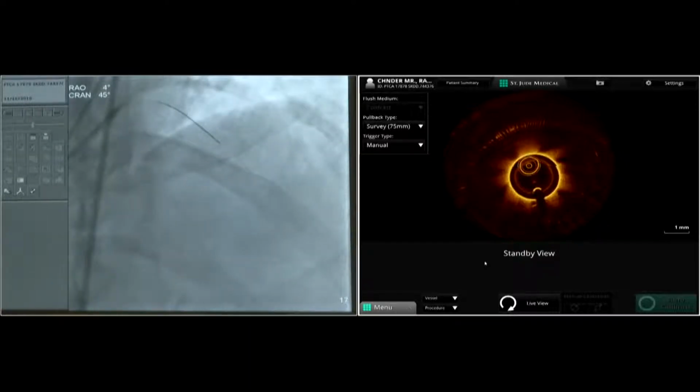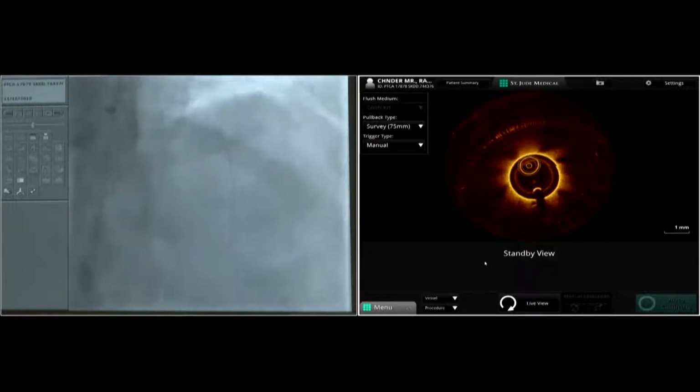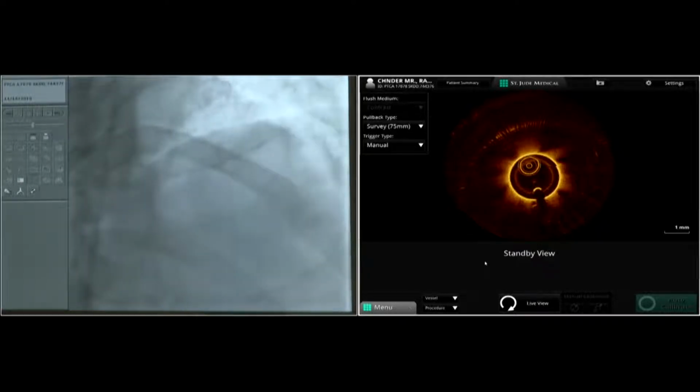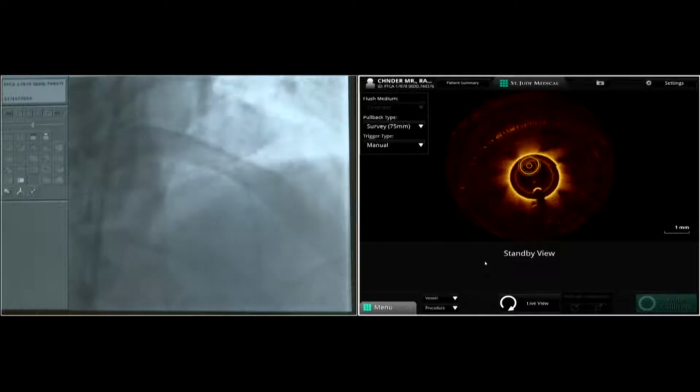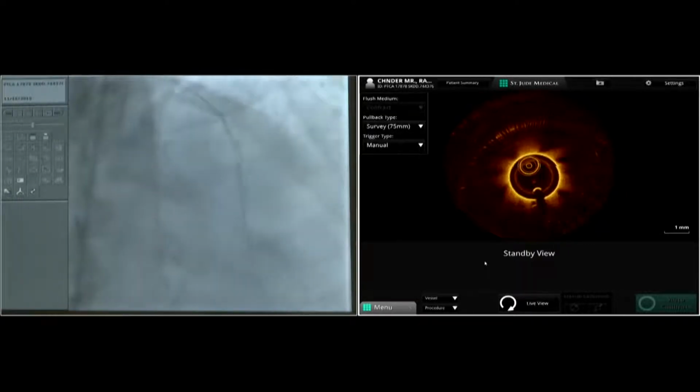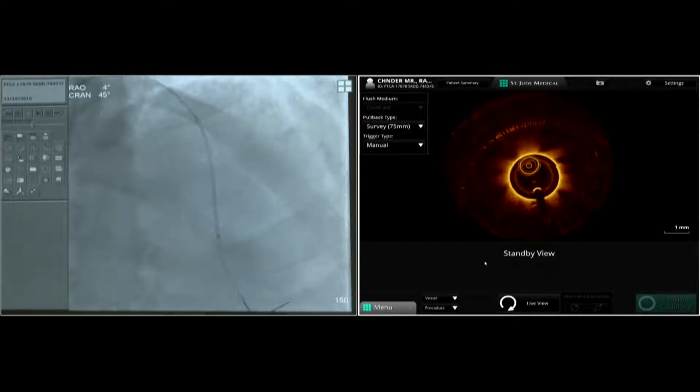So we would do an OCT of this lesion and then size it, and accordingly then we'll prep the bed as any absorbable technology requires, and then we would do an optimization again with the OCT technology. So you're using imaging not only to size, but also to look at the properties of the plaque in order to do the appropriate PCI. Yes, that's right. Absolutely.